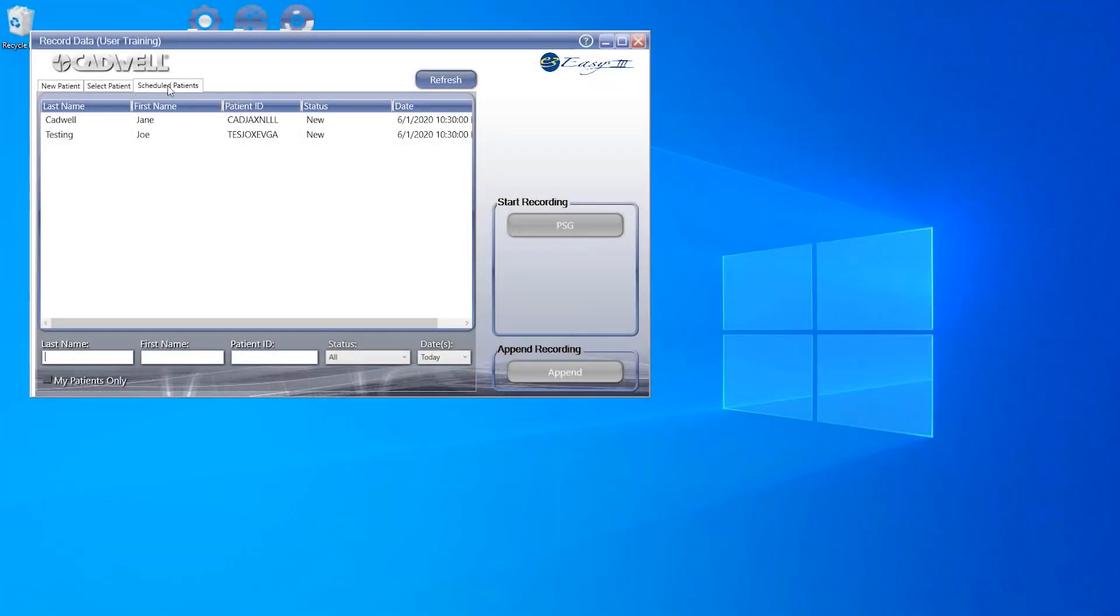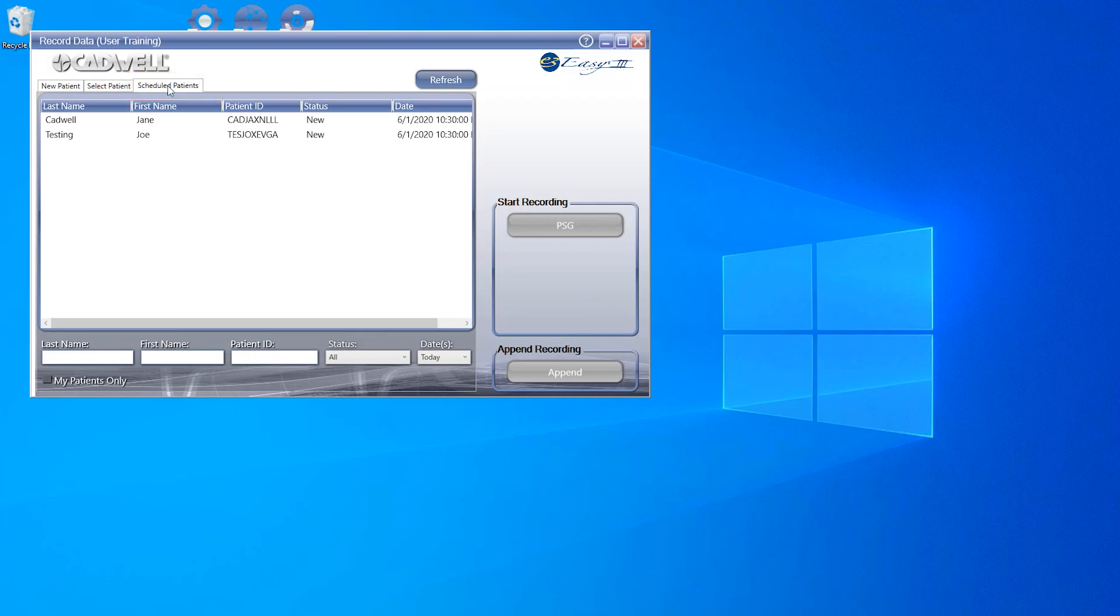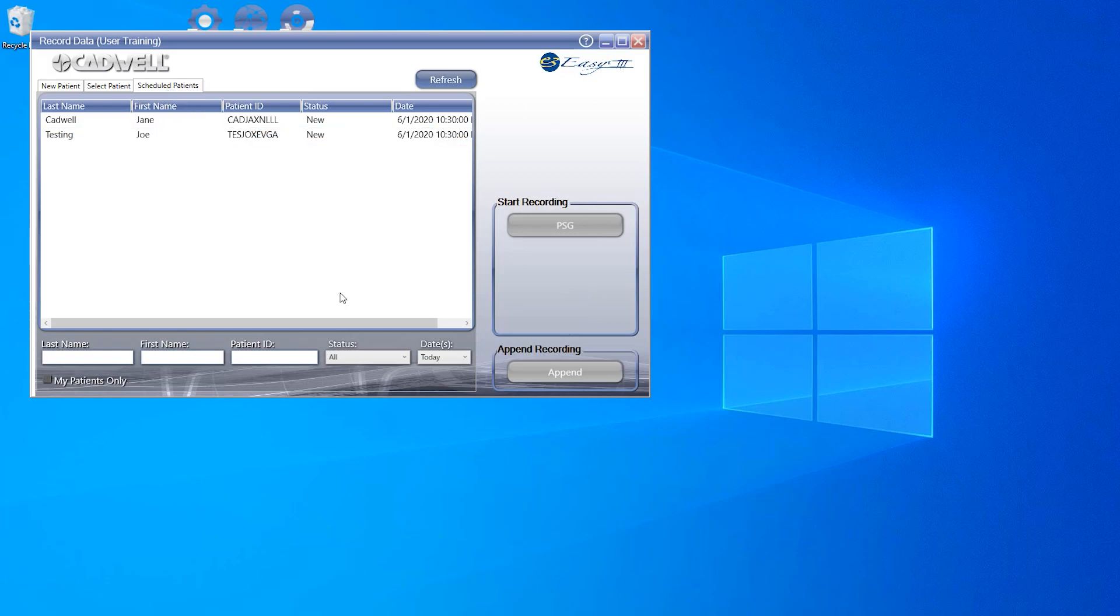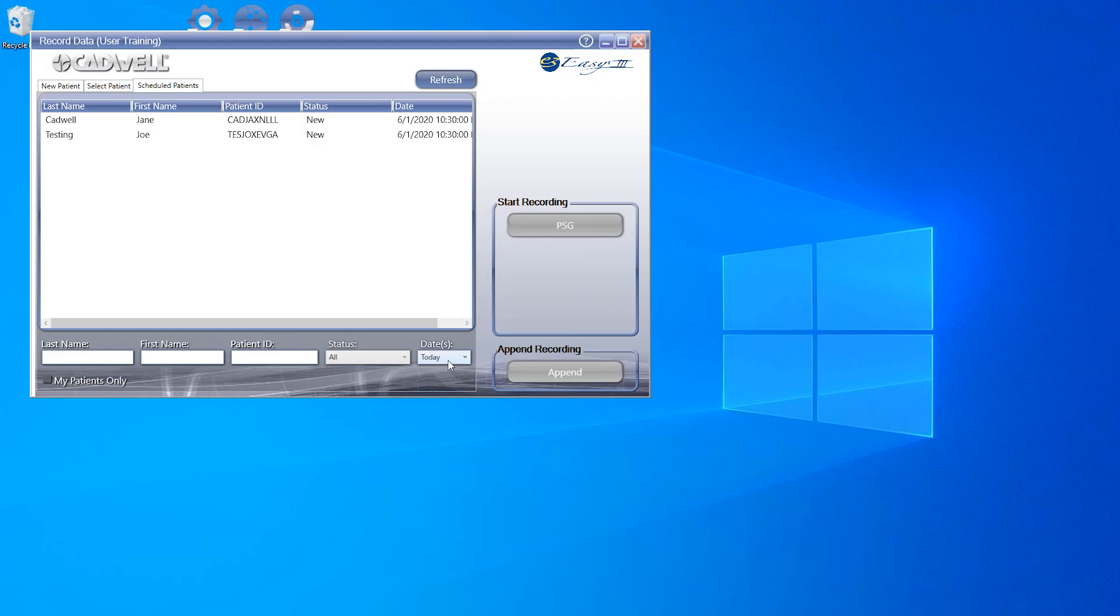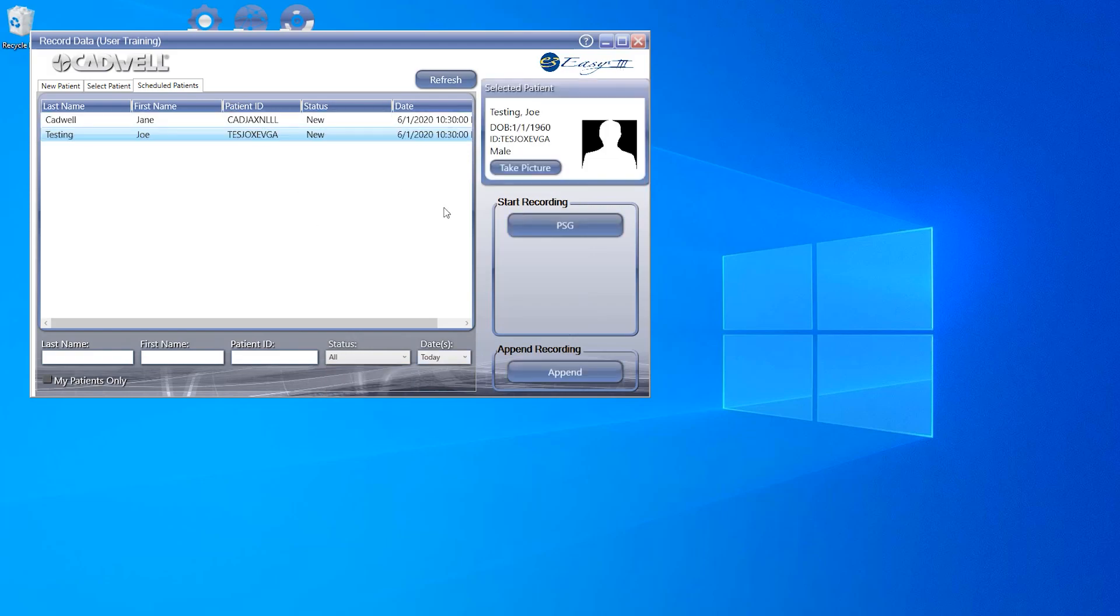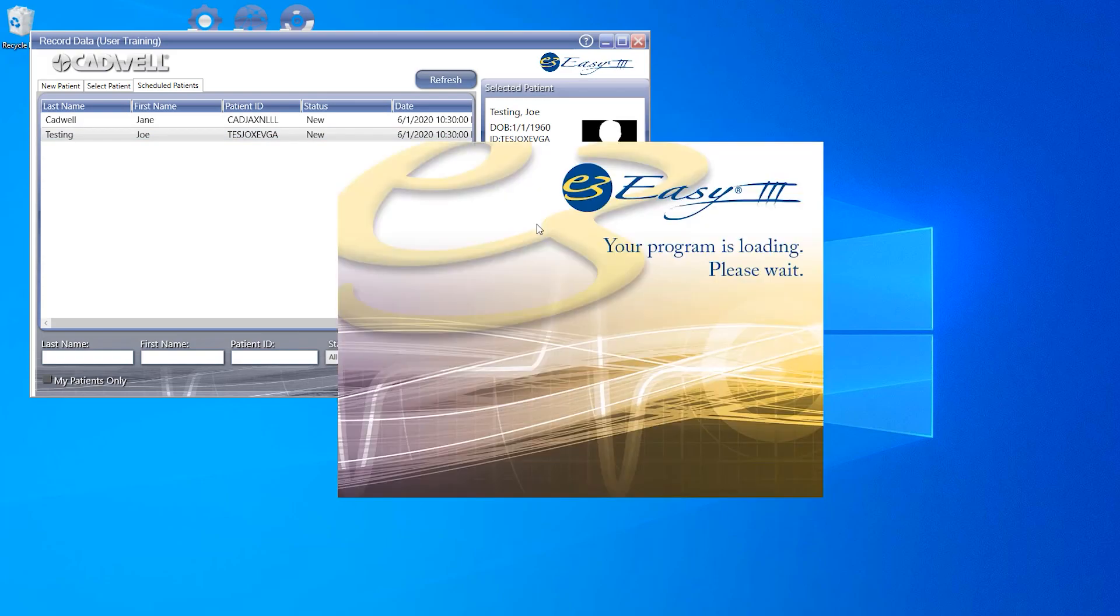The final way to start a study is to use the Schedule Patients tab in the Record Data Dashboard. This will be used by facilities that are using the Cadwell Scheduler or have the EZ3 system interfaced with their EMR. Like the Select Patient tab, this is a searchable list. You will be able to search this list with some new identifiers by searching by Status and Date. Once you've selected the correct patient, click the PSG Recording button.